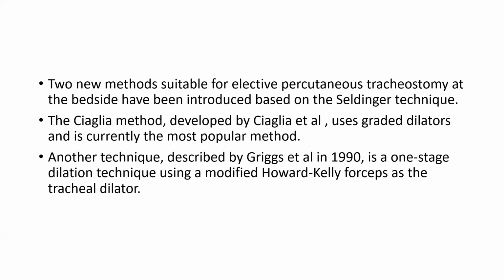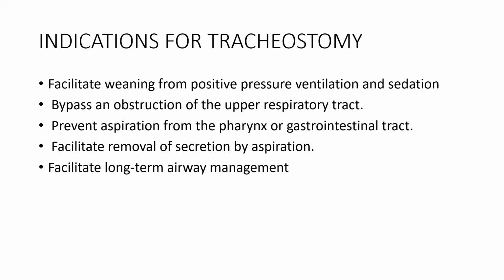Two new methods suited for elective percutaneous tracheostomy at the bedside have been introduced, based on the Seldinger technique. The Ciaglia method, developed by Ciaglia, uses graded dilators and is currently the most popular method. Another technique was described by Griggs et al. in 1990. It is a one-stage dilation technique using modified Howard Kelly forceps as the tracheal dilator.